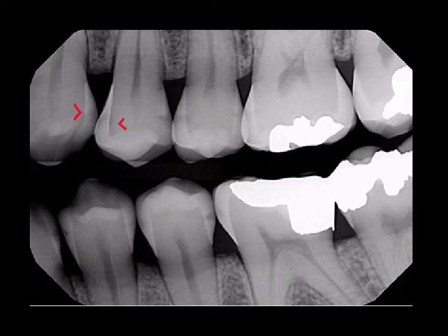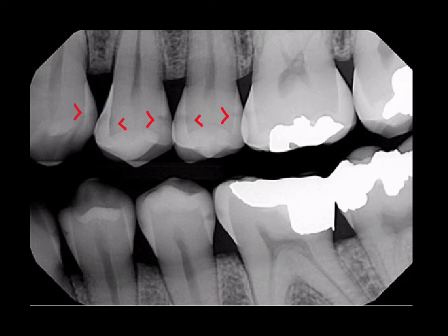Here we see decay where there's a little radiolucency in the dentin — this is beyond incipient decay because it is now involving the dentin, so this would need intervention. A little more pronounced on the distal of number 12. We can see it on the mesial and distal of 13. It's hard to identify decay on the mesial of 14 due to interproximal overlap — this horizontal overlap is why we take both an anterior and a posterior bite wing.